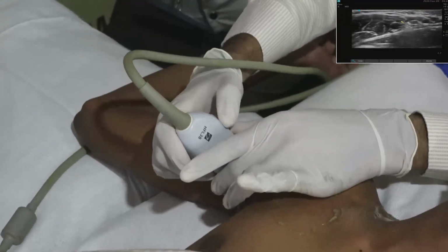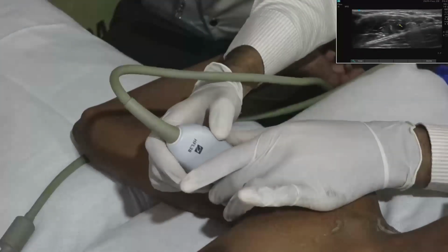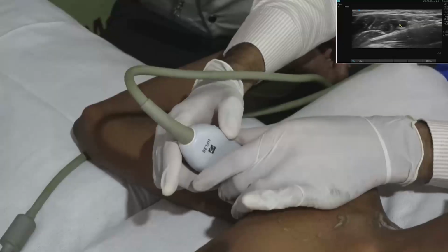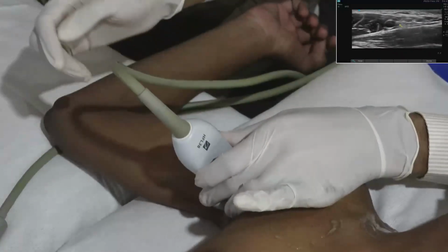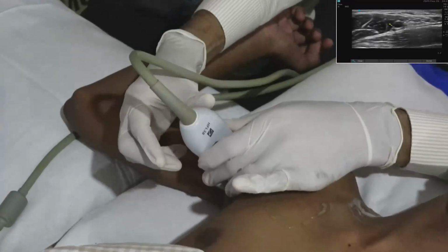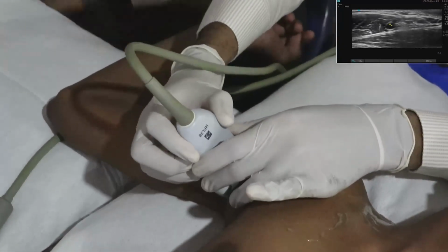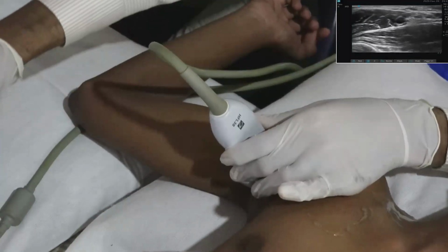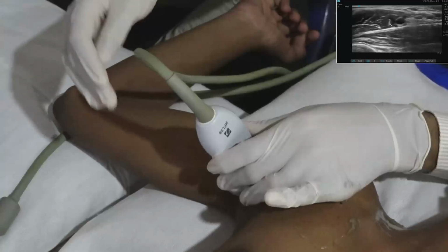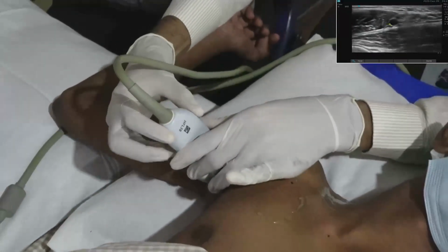Sometimes we see 2 axillary veins, sometimes 3, rarely we see 4 veins also. It is very difficult to identify the individual components, like which is ulnar, which is median, or which is radial. It is difficult to identify just like that. So whenever we have any difficulty, we have to go for distal scanning and come towards the axillary area.